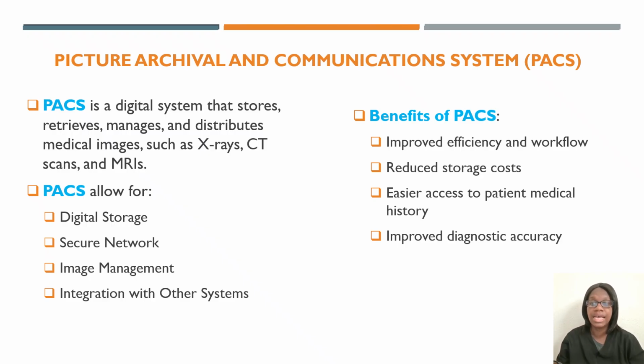It's easier to access the patient medical history. Hence, that's why I told you how long you should wait before deleting the images from the CT machine. You don't have to worry about that with PACS. And it has improved diagnostic accuracy.